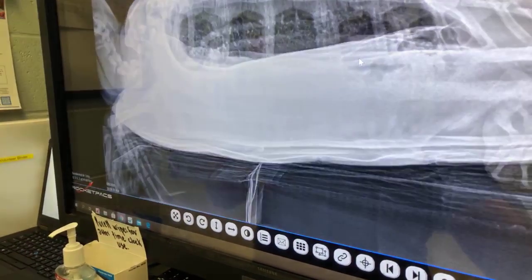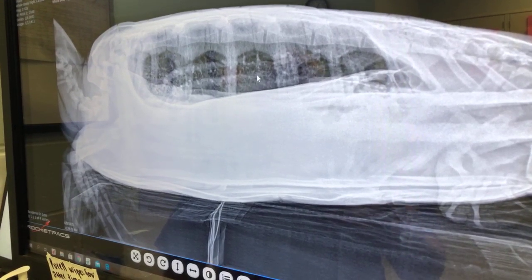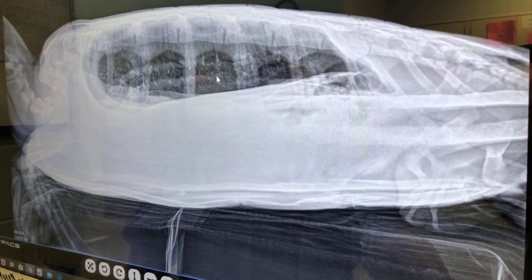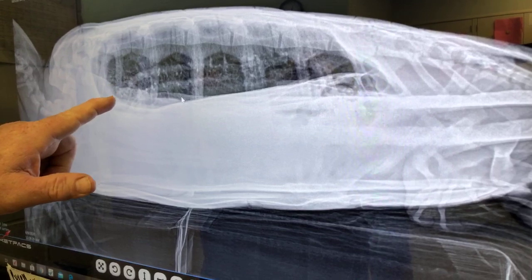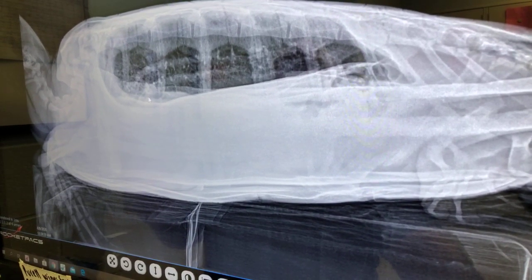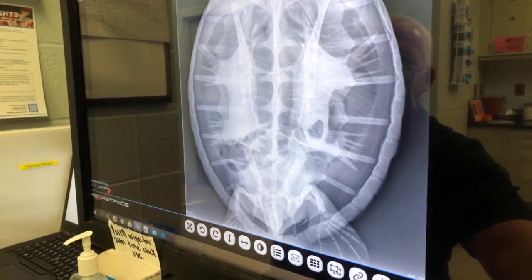we're going to go ahead and look at this side view. These are the two blood vessels that go along into the lungs so that they can pick up the oxygen as the turtle comes up to surface and takes a few breaths. It exchanges air, and then the red blood cells can then carry that oxygen back into the body. So on this, what I'm seeing is a kind of pale area right here. That coincides with that other view that we saw where there was a little bit of material. I'm going to point here with the pointer so I don't touch it. We can go back and see if we can see that again. So that coincides with this here that we were seeing earlier.